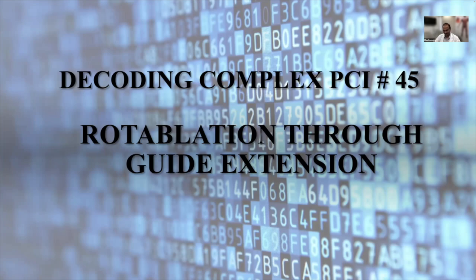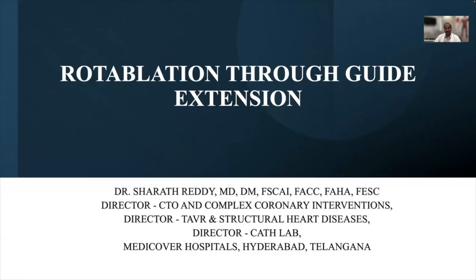Welcome viewers. So today's session is about decoding complex PCI. It's a case of tortuous calcified right coronary lesion where we did plaque modification with rotablation through guide extension. I'll take you through certain nuances of how to use rotablation through guide extension.